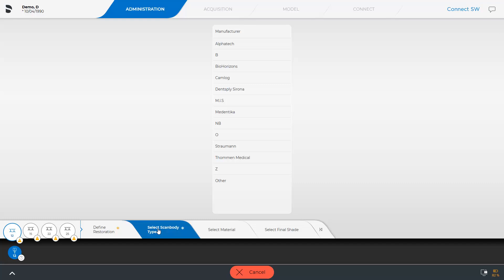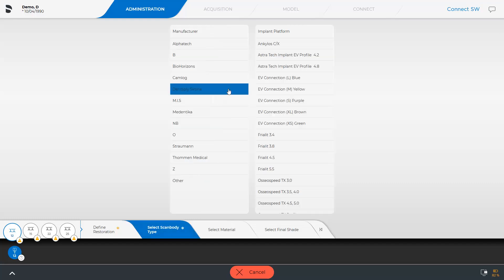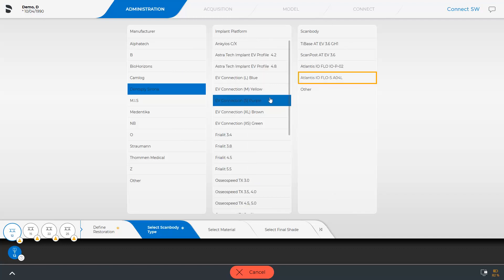A window opens from where you select the implant manufacturer, then the implant platform, and last, the scan body to be used. In the case of Atlantis superstructures, an IO-Flow-S must be used. Depending on the implant manufacturer and implant platform, the correct IO-Flow-S scan body is automatically displayed.